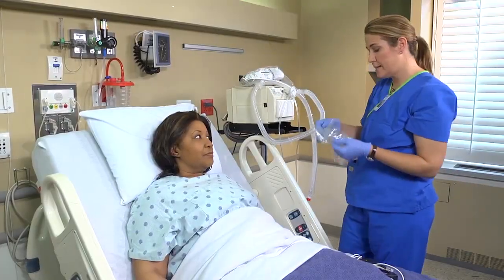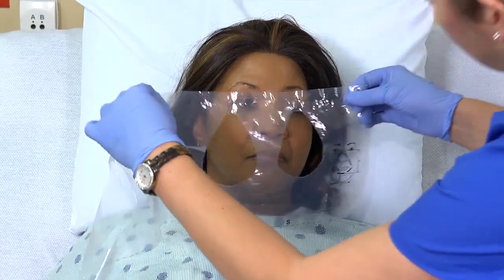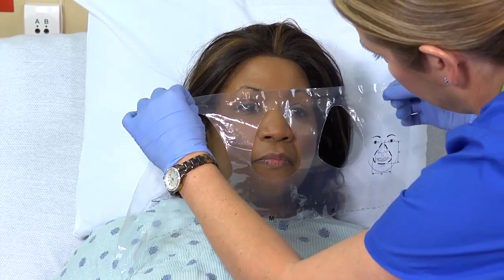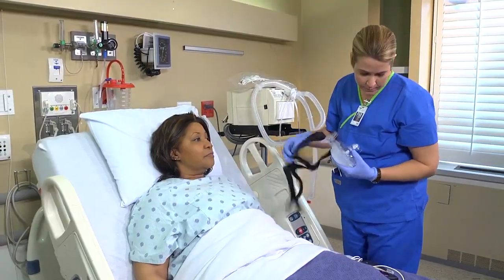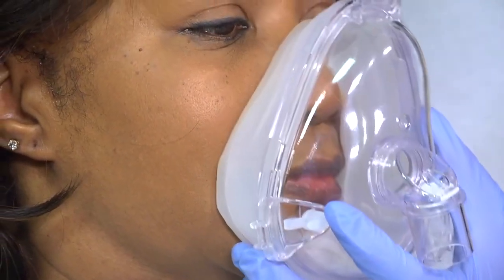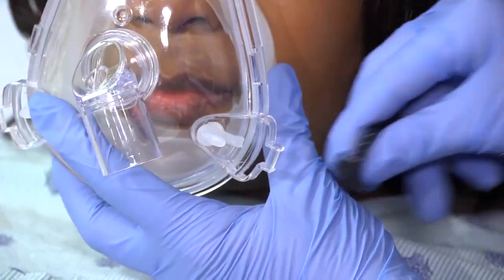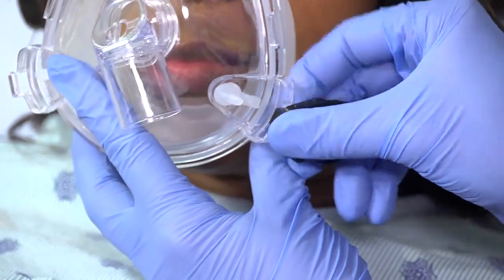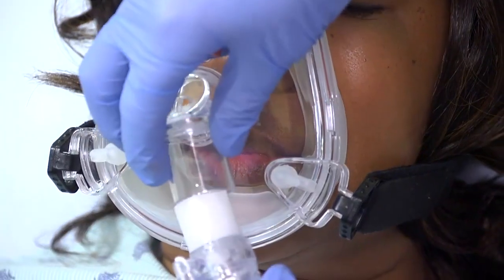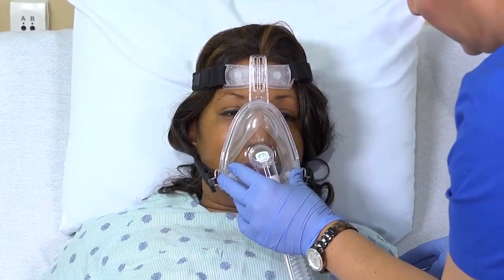Use a masking chart to determine the correct size CPAP or BiPAP mask. Place the mask over the patient's nose or face and adjust the head strap until the seal is as tight as she can comfortably tolerate. The mask must have quick-release straps. Turn on the pressure generator and connect the CPAP or BiPAP tubing to the patient's mask.